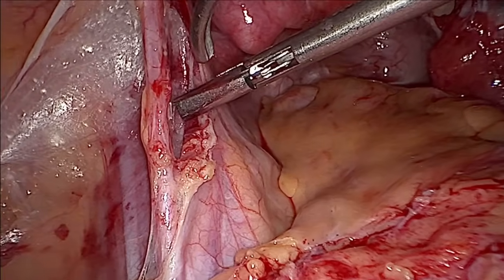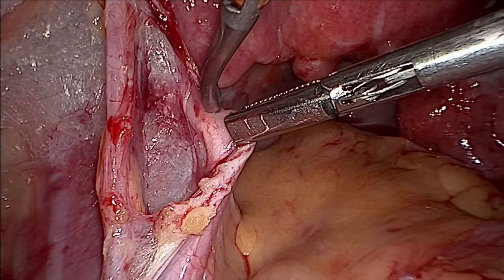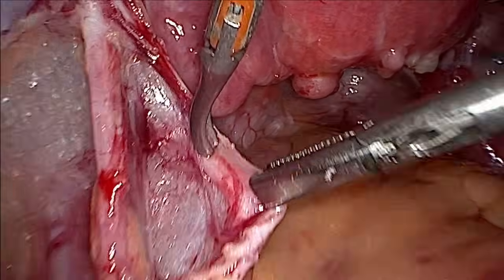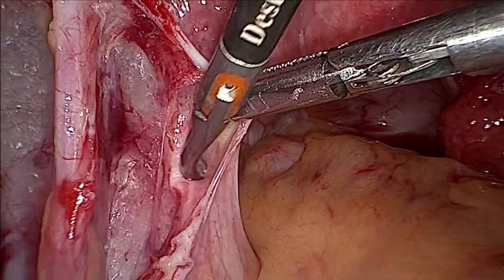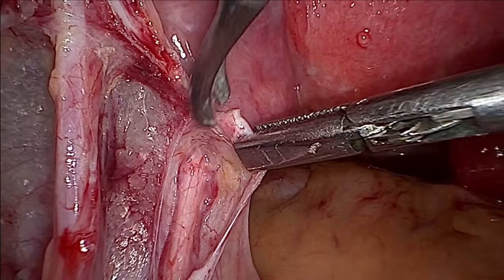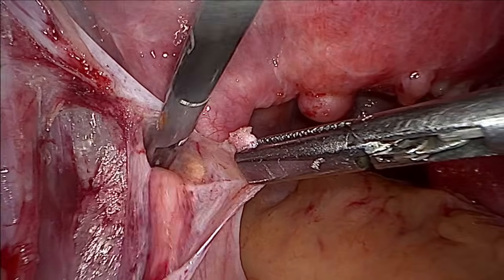You go here. You lift and here you can see, this is the ureter. You just keep a small neck here, just give a small neck, and you are now in the plane of the ureter. So this is the ureter here. Always anterior dissection, as we know.